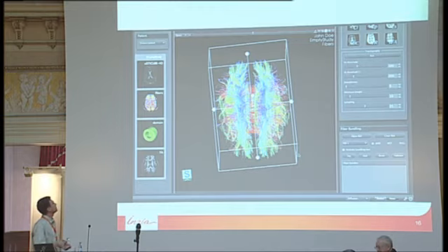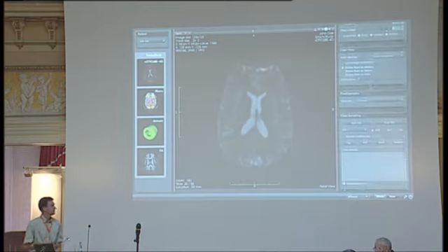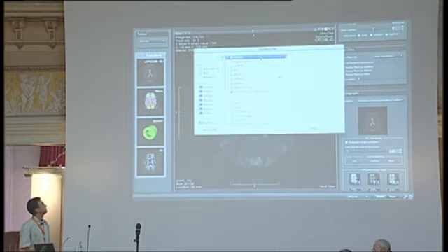So I don't know if I will be able to start this video. Oh yes, thank you. So this is a video illustrating how the pipeline in DWI is working. So here you have a DWI that has been loaded, and you're just going to drop it into the tractography pipeline, and it's going to ask you for the gradients, so this is taking a bit of time, because you have to find the file.